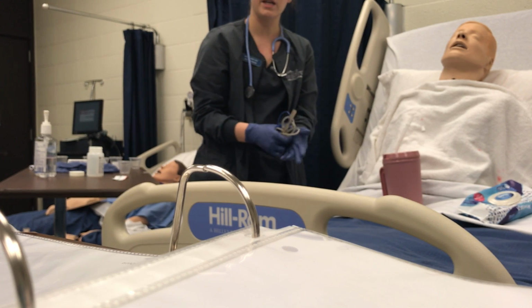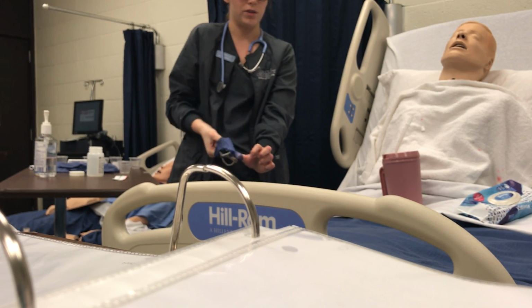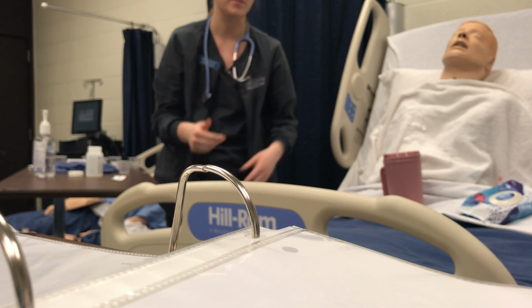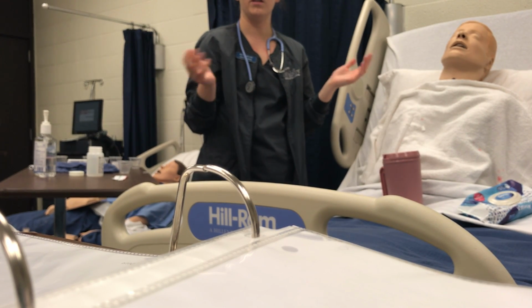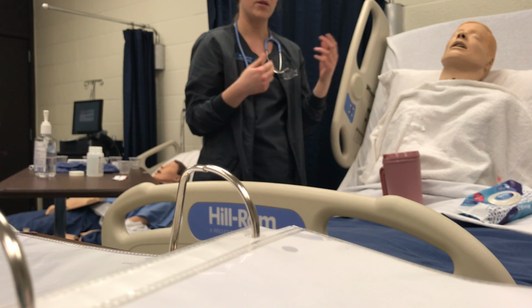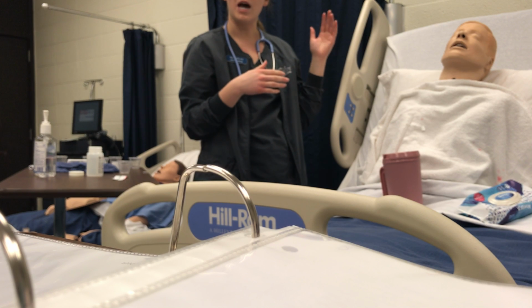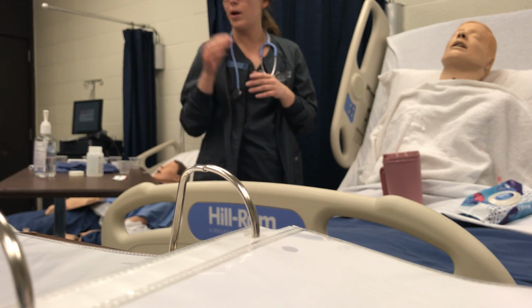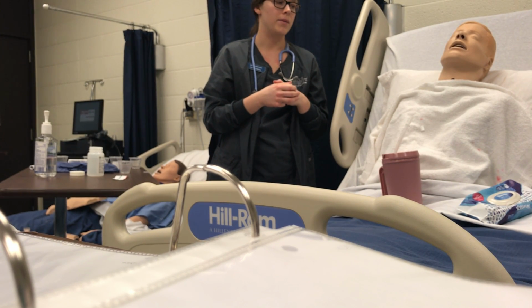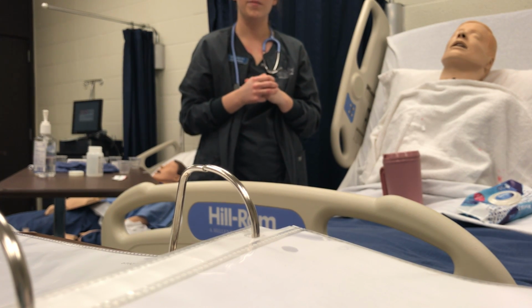So I would help them clean up, get any kind of gastric contents or anything that came out of their nose, get that all cleaned up. I would document any relevant data, how they did with this procedure, any residual that came out, all of the consistency, amount, if they were hooked up to suction, how much had come out already. I would document all of that. And that concludes my NG video. Thank you very much.